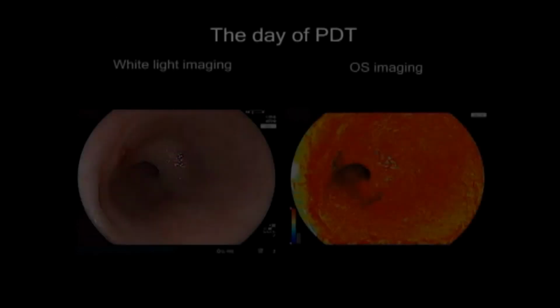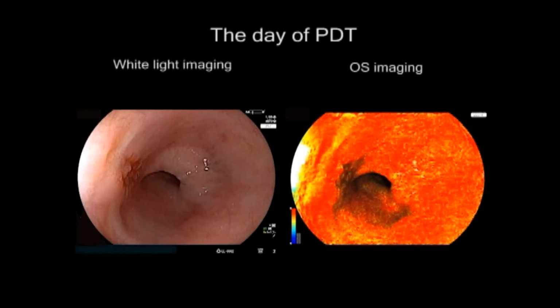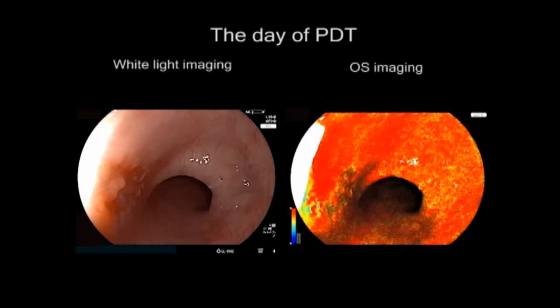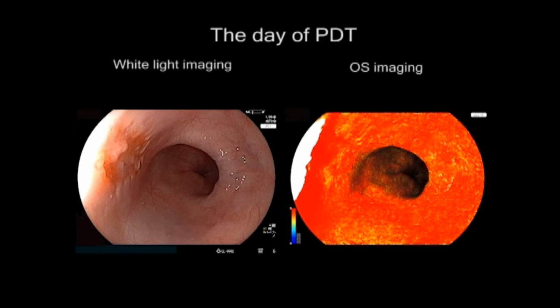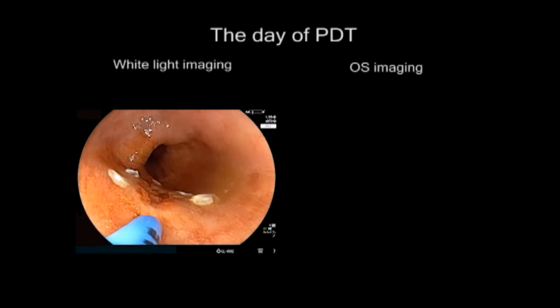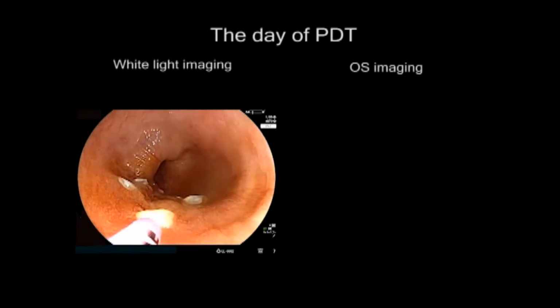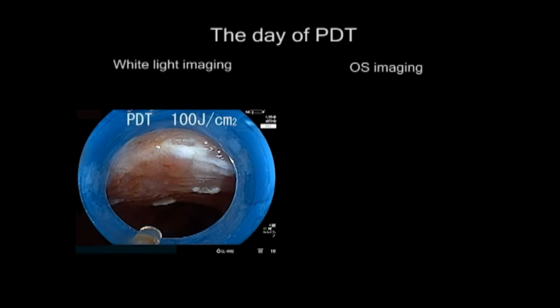The case was a 74-year-old male with local recurrence after chemoradiotherapy for esophageal cancer. The lesion was located at the low thoracic esophagus and the clinical depth was T1b. The pathology was squamous cell carcinoma. After APC marking, 2 illuminations were planned according to the size of the lesion.